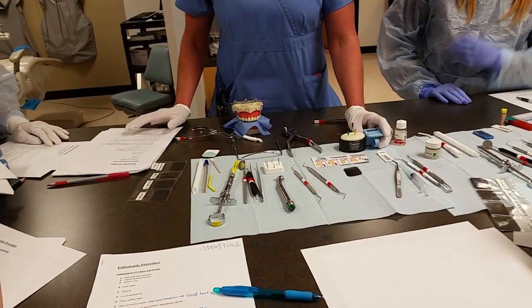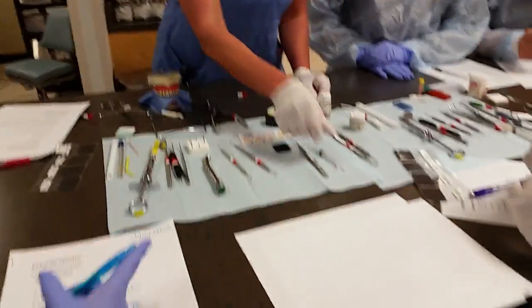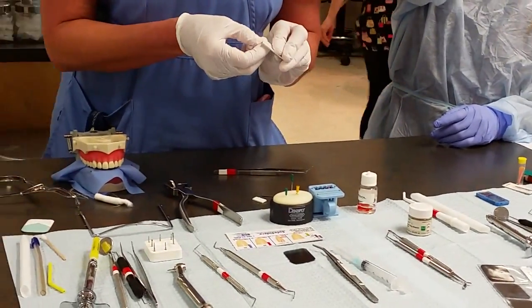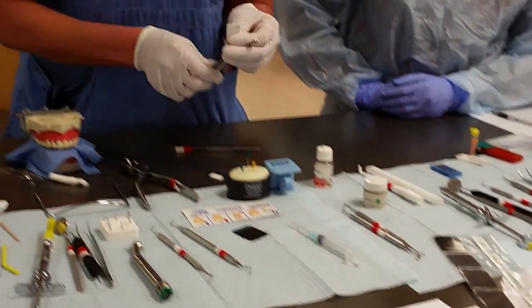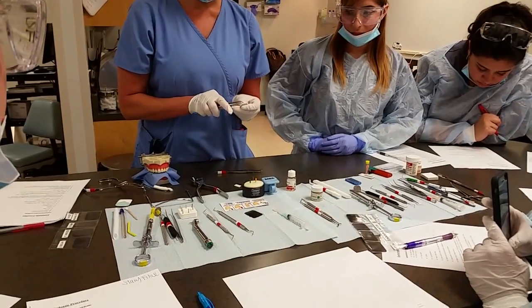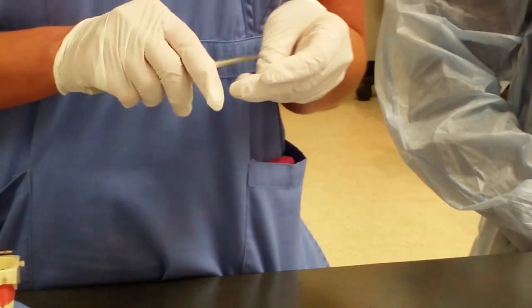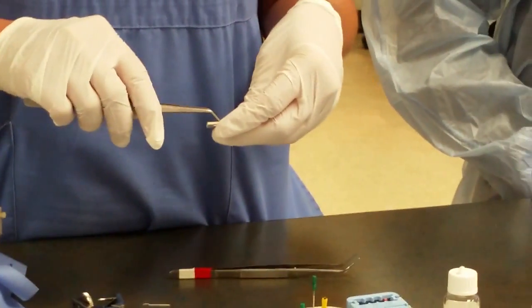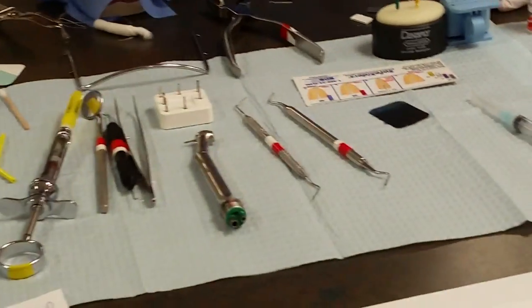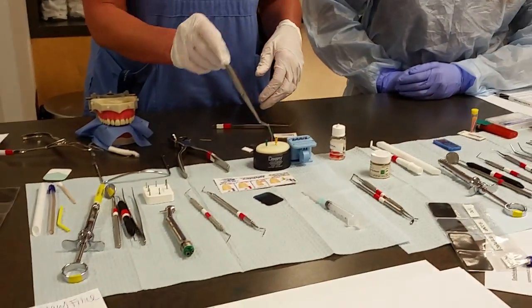Once we've reached file 25, we're going to irrigate the canal with sodium hypochlorite — which is bleach, possibly 50/50 with water. After irrigating, we use paper points to dry the canal. The paper points are very precise and thin to make sure there is no water inside the canal. We measure the paper points the same way, use locking cotton pliers to grab the paper point, and dry inside the canal.